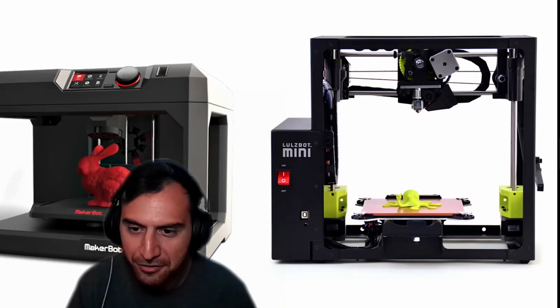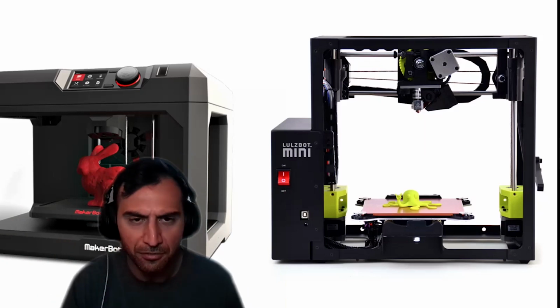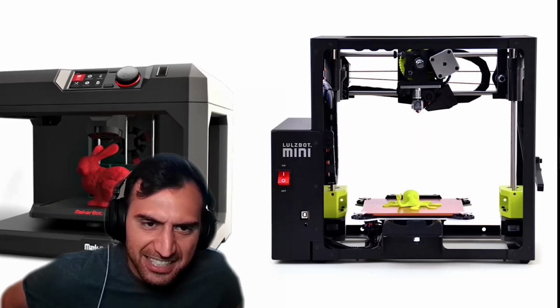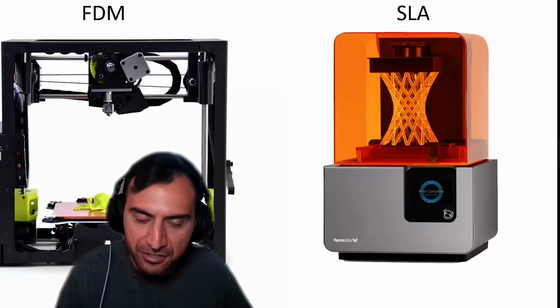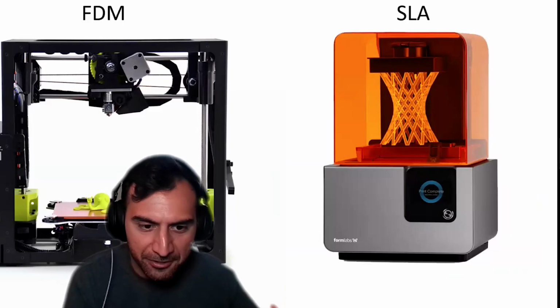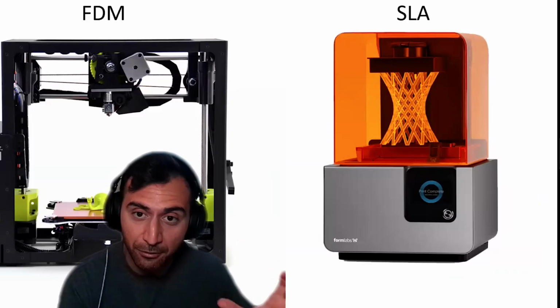These were some of the first printers, I would say MakerBot, the Lulzbot. These were some of the first commercial printers that people were buying up, and Formlabs existed. But in that era, we were mainly printing with what we call filament printers. So there are essentially two printers that developed around that time. The filament printers, which still exist in dentistry, and they still have a purpose in dentistry too. They have a role to play.